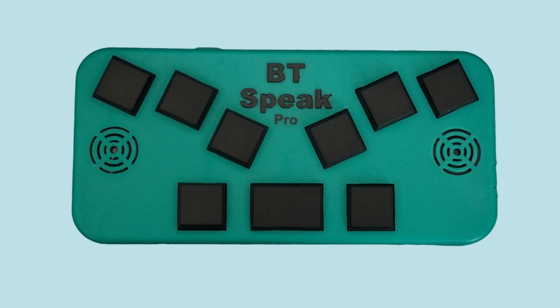And I was pressing dot 4 chord to move from one line to the next. The opposite is dot 1 chord. So if I press that, that goes to the previous line. 2 things were certain every Saturday. Growing up. Pancakes blank. Let me move back to that line. 2 things were certain every Saturday. Okay, if I want to reread the line, I press both keys, dots 1 and 4 with the space bar. 2 things were certain every Saturday. Growing up. Pancakes 4.